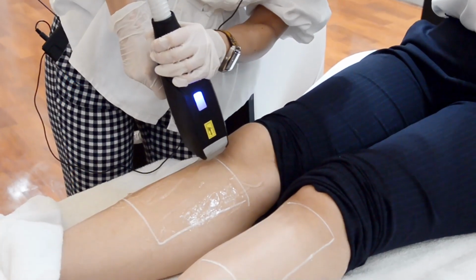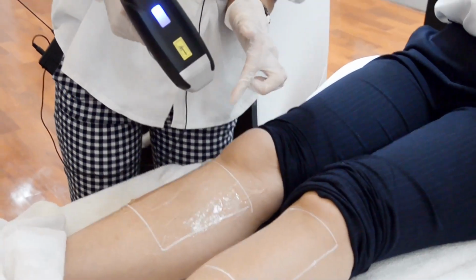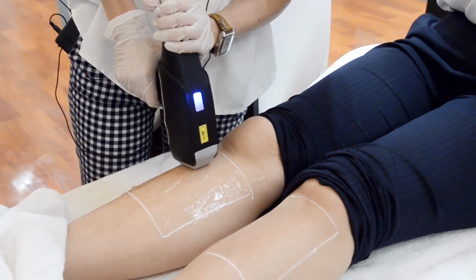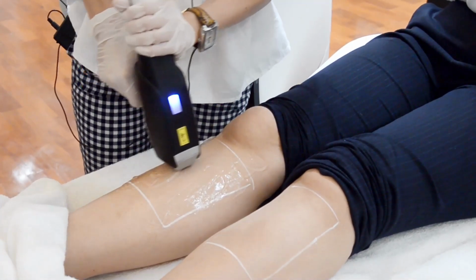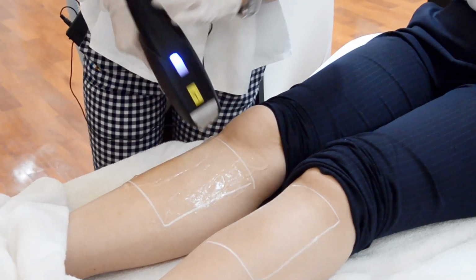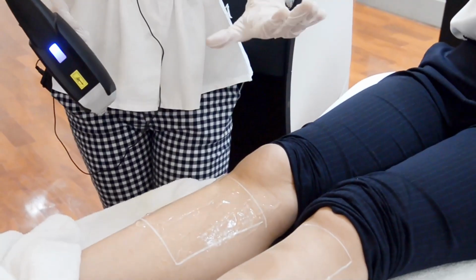And there's also a 1 degree constant cooling for the patient. So before I start, for a first time user, you might just want to glide to make sure that you are familiar with the motion. And at all times, the handpiece has to be in full contact with the skin.